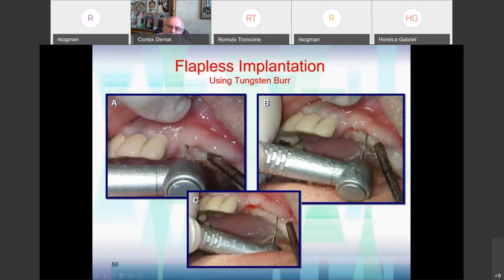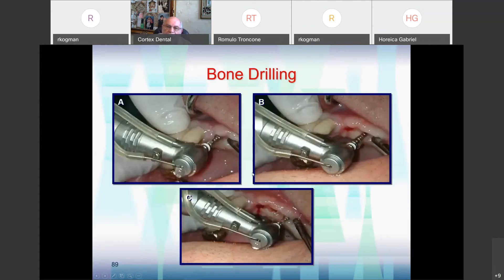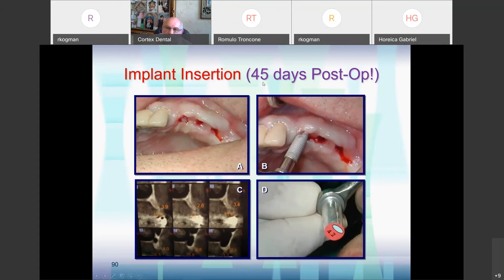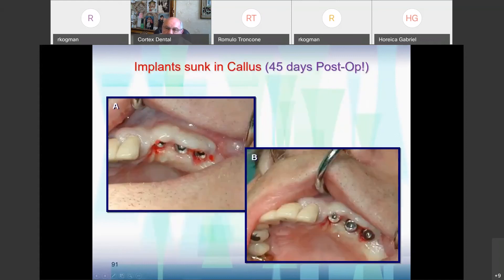Using the Ariane tungsten bur to go through the soft tissue and insert the implants into place. A 4.2 mm implant was inserted into a 2.6 mm crest — imagine the advantage. All of this is just 45 days post-op only. I do not have to do augmentation and wait 4 to 6 months. One and a half months after the operation I insert the implants. You can see the implants in place. Then I performed the sinus lift — here you can see the sinus lift. This is the panoramic x-ray with implants in place.